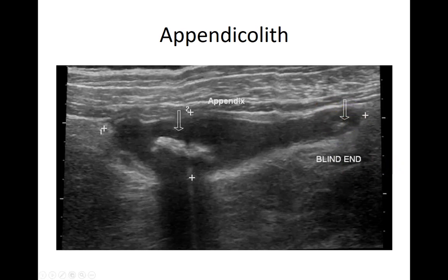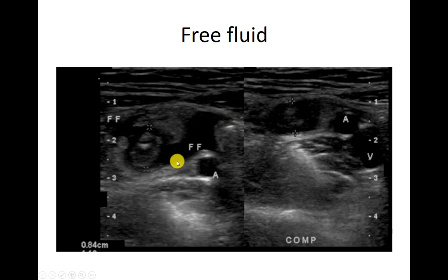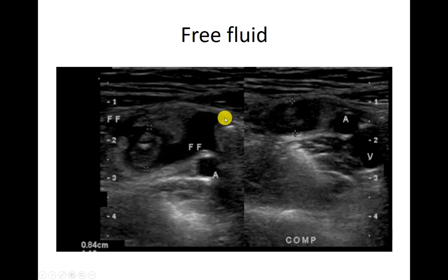Here's an example of some free fluid. This circle right here is the appendix, measured from outside to outside. And this is the free fluid right here. Here's a couple of vessels, but we're concerned that this stuff is not a vessel — this is free fluid. We know that because it comes to little points. Anything pointy is usually free fluid.